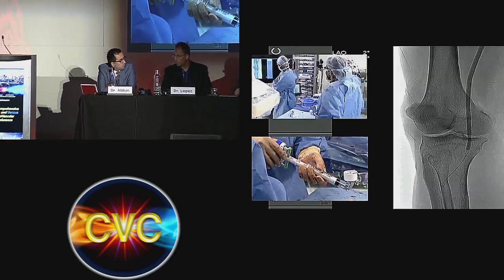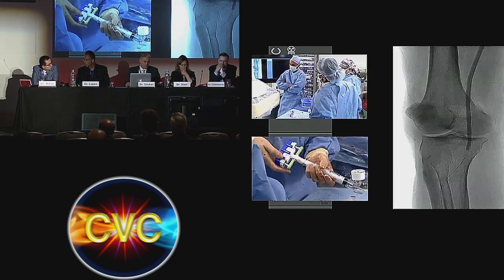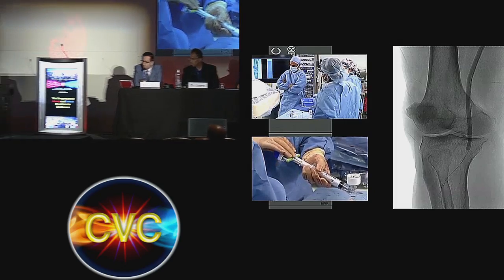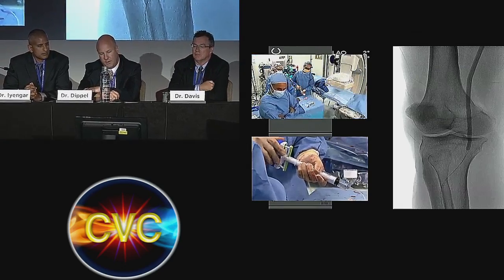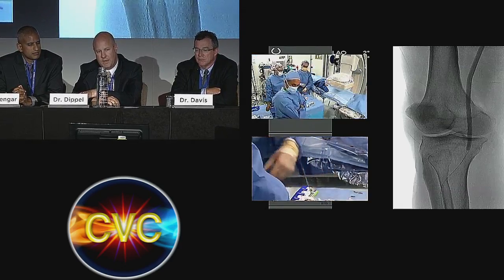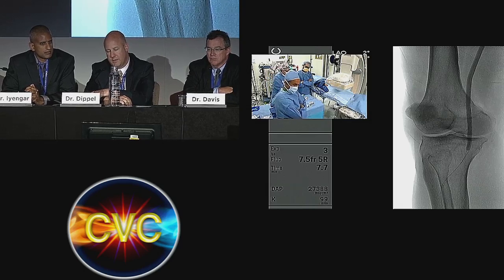Miguel, the answer to your question is that this data has been done. It was done in the 1980s in the coronary arteries and in animals before there were ever stents or ReoPro or Angiomax or anything else. And there's definitely a clear relationship between long, slow balloon inflations and better outcomes, with fewer dissections. Arteries have a viscoelastic property.